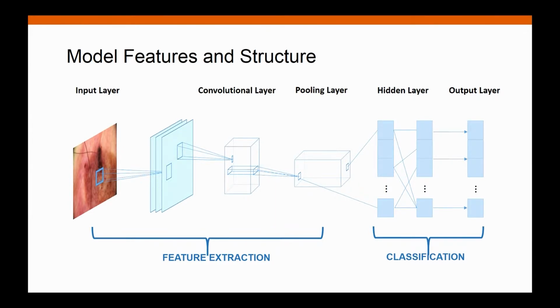The convolutional layer uses a filter matrix to extract useful information from the image matrix. After the convolutional layer, we downsample our image by using the pooling layer. Here we use max pooling. This downsampling method can also help to reduce memory consumption and save more space for the convolutional layer.